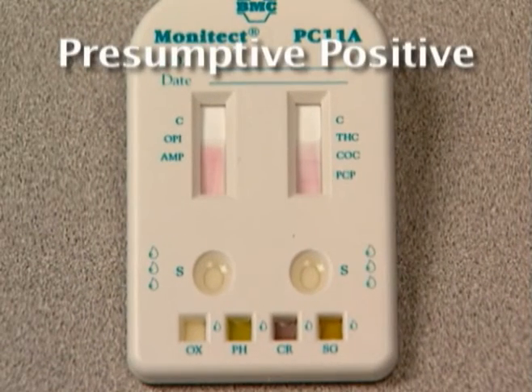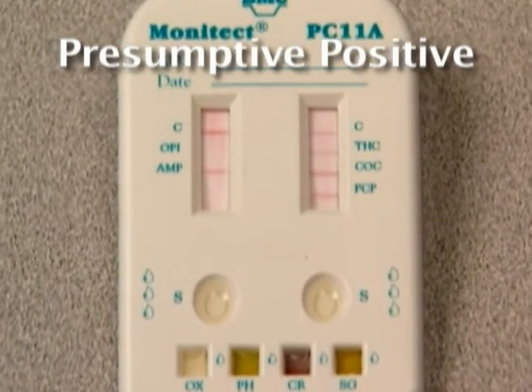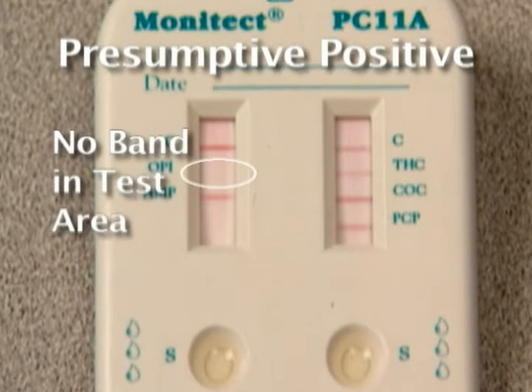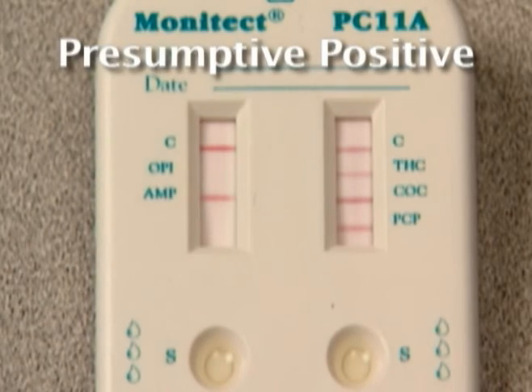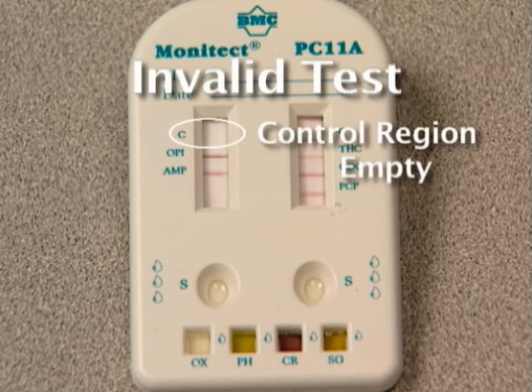Presumptive positive results can be interpreted once the control bands C form and the membrane background clears in 5 minutes or less. A presumptive positive result will show no band in the specific test area. Results are stable and may be interpreted for up to 15 minutes after the control bands C form. When no band appears in the control region, the test is invalid, even if there is a band in the test region. In this event, repeat the test with a new device.